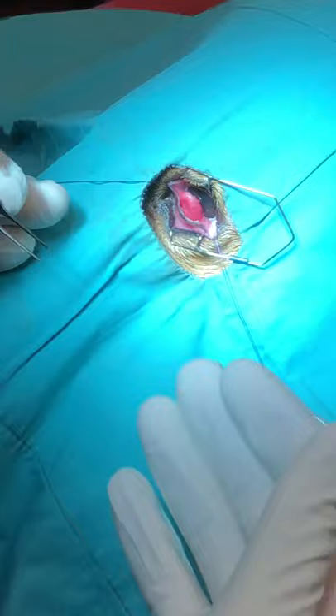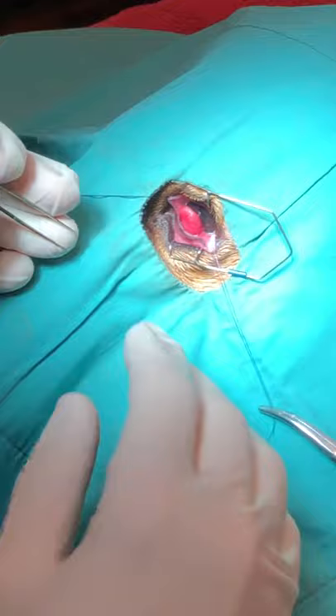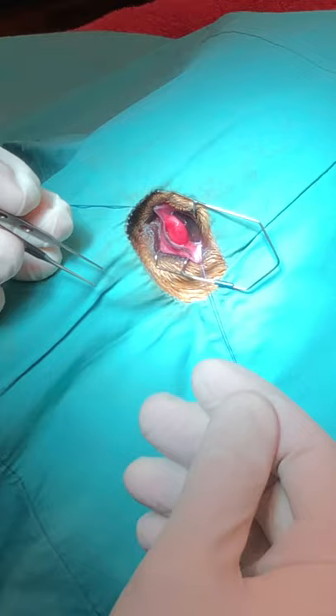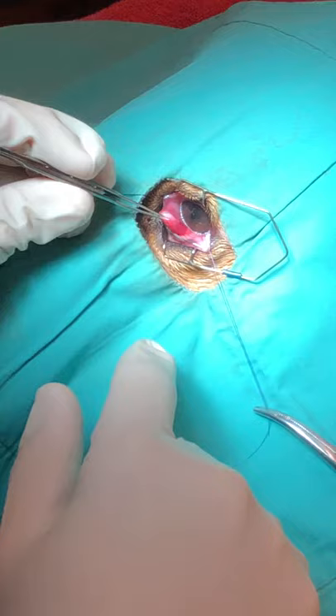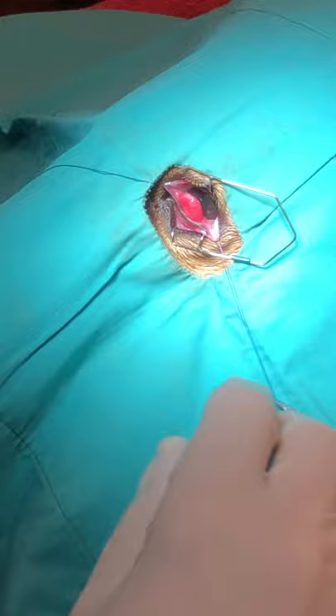The dog's laying in ventral recumbency with the head propped up on some towels to keep it nice and level. You don't need to shave any of the hair or eyelashes around the eyes unless it's a really long-haired dog and you think they'll get in your way. Prep with betadine both around the eye and in the conjunctival fornixes and on the gland itself. It's not going to be a sterile procedure but you want to be as clean as possible. You want to start by putting some stay sutures in — that's going to maximize your visibility and make your life a lot easier — and then eyelid retractors to keep everything out of your way.